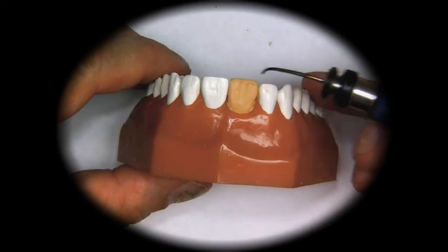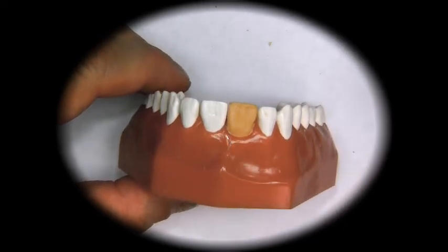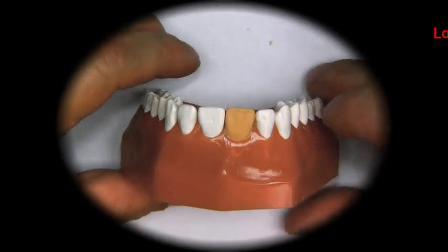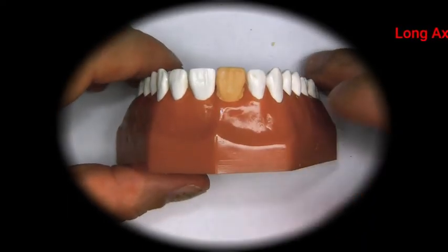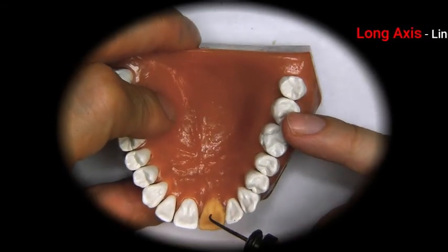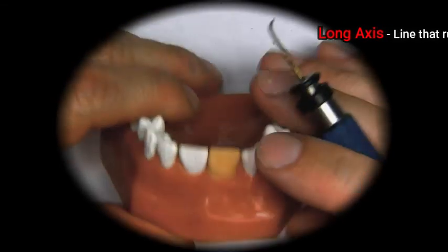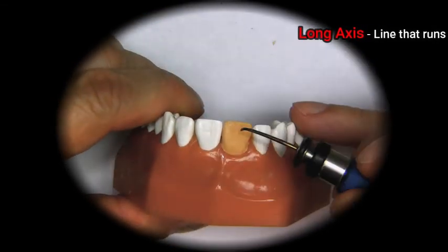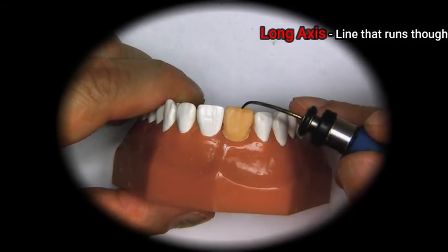This makes it look like we don't have a perfectly straight long axis. Now the long axis of the tooth is a line that goes right through the center of the tooth. You get right on the center, and it also goes through the center right here.